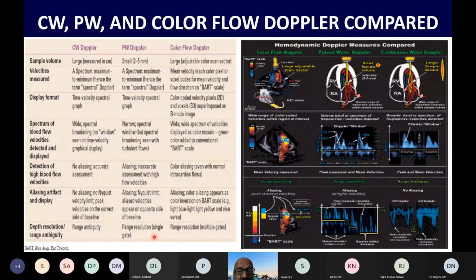Color flow is the modified pulse wave Doppler, where you're using the advantage of color signals. Blue is away, red is towards, and this can be used to quantify the regurgitant jet area, but it is subjected to technical problems. You have to set the color Doppler frequency exactly between 50 to 60 centimeters per second. Otherwise, it will show the color jet bigger or smaller depending upon the settings you have kept on the machine. So this is also important.